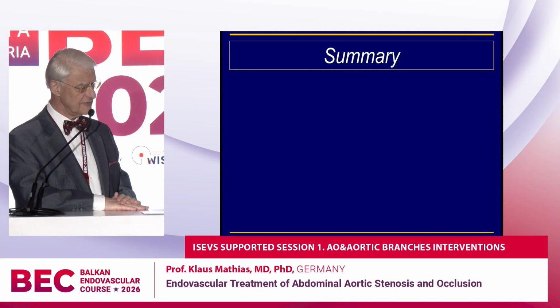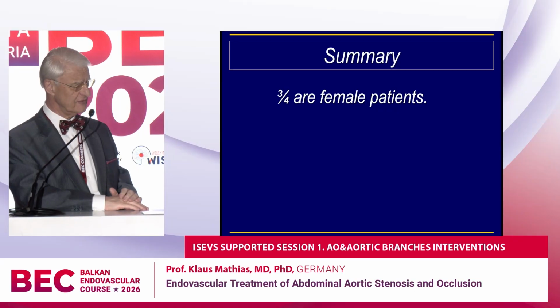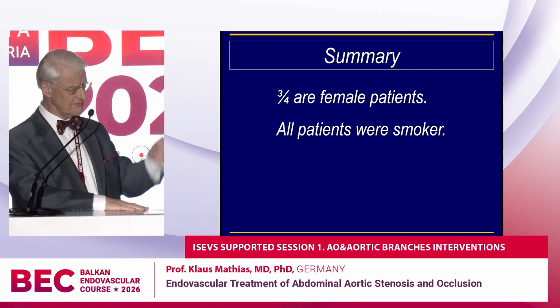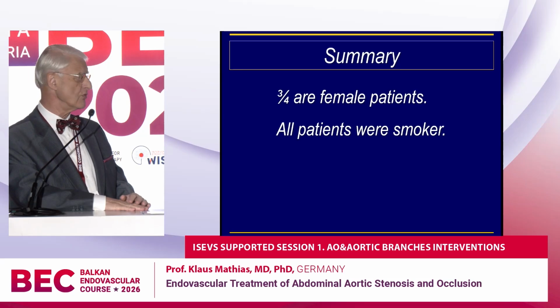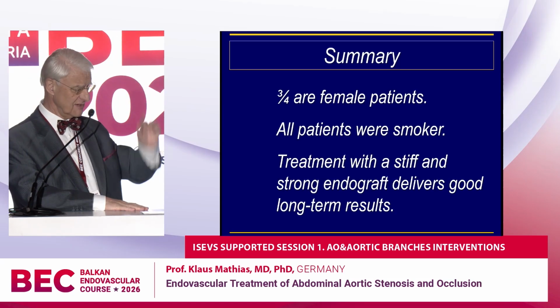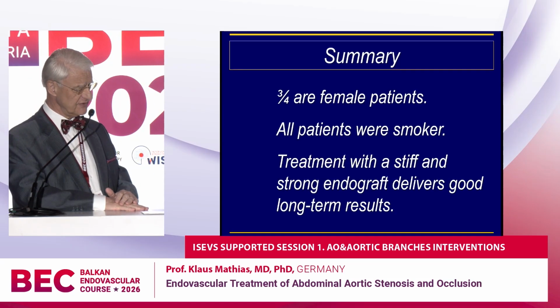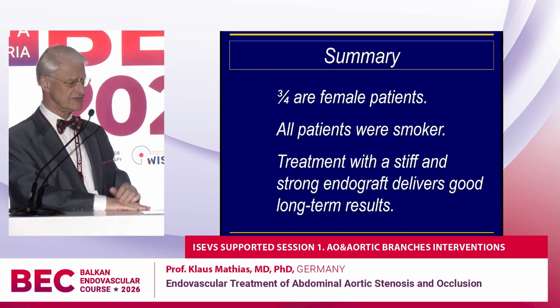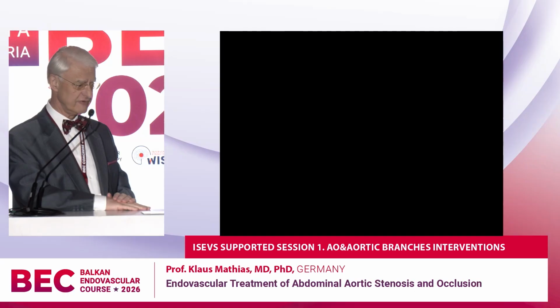Next. So the summary is, three quarters of them were female patients. All patients were smokers. Treatment with a stiff and strong endograft delivers good long-term results. And thank you very much.